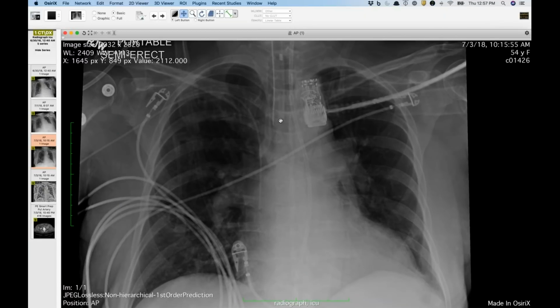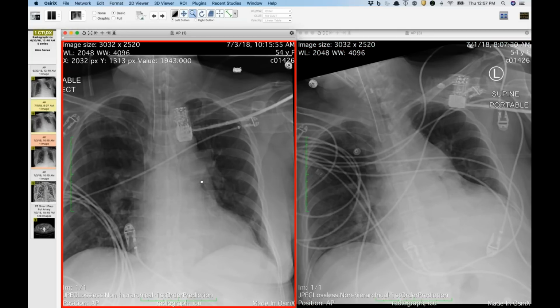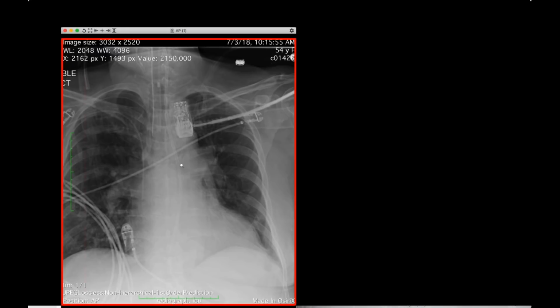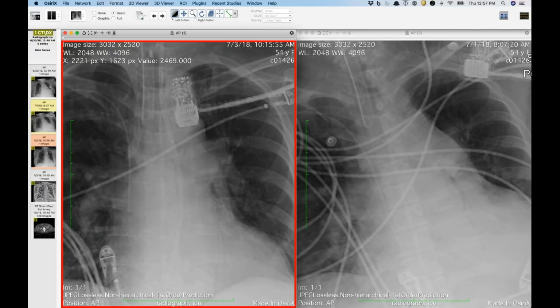So it's just a portable radiograph, and you can see the patient's intubated. And this was the radiograph I saw. This is a couple months ago, and I'll pull up the immediate prior from 2 days before that, just so you can see. She has known pulmonary arterial hypertension, big pulmonary arteries. But I think that this is one of the best examples I've seen of this in a while, where if you guys see the abnormality.